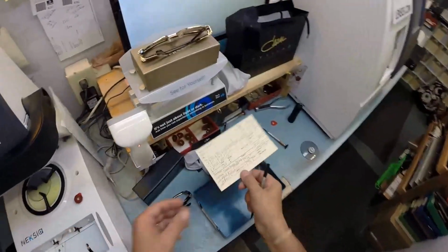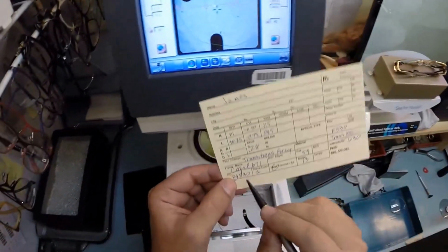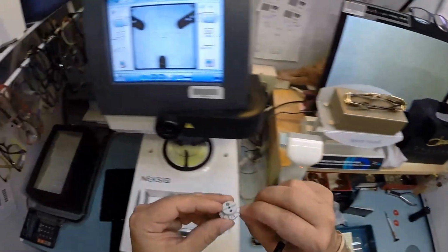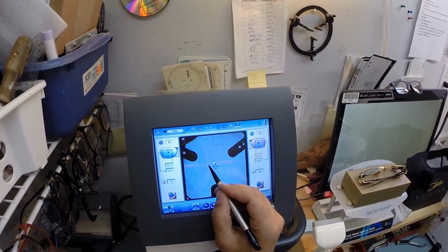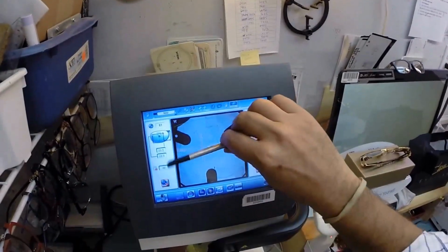Do the same thing with your pupillary distance. See that it mirrors the right side, so we're at 29.5, but it's 30. So I'm going to tap that and go up 1 until we get to 30 millimeters. Pull the paper away to make the black side sticky. Line up the magnet there. Get the lens oriented just perfectly, where your optical center is inside the orange crosshairs. The other 2 dots are lined up perfectly.